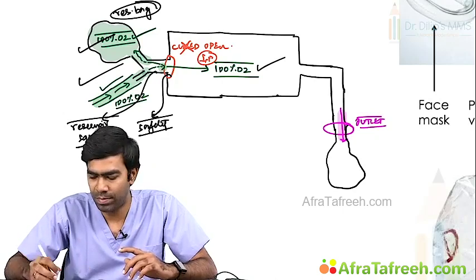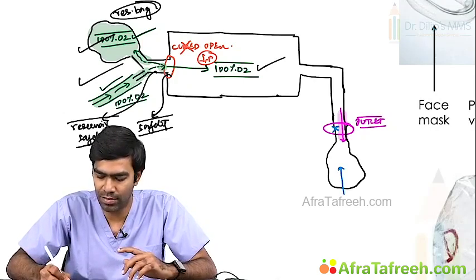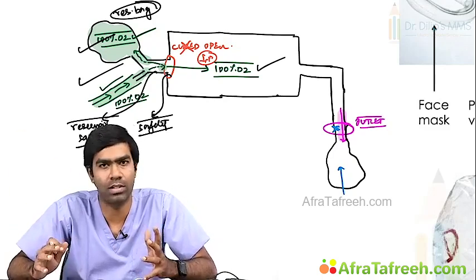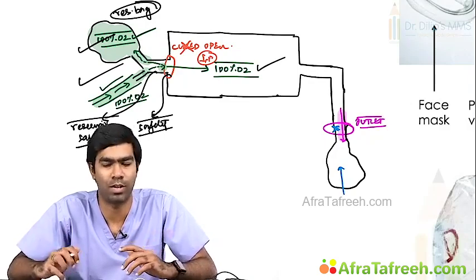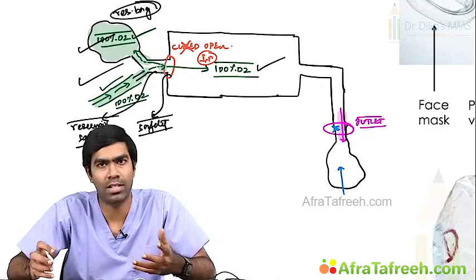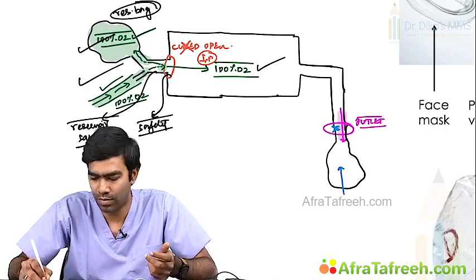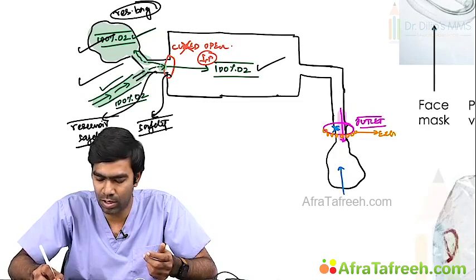Now what if the patient exhales? If the patient exhales, I told you this valve definitely won't allow the gases to escape into the self-inflation bag, because that's the function. It will not allow rebreathing at all. So how are the exhaled gases going to go out then? A lot of ambu bags and any other company's bags also will have these exhalation ports near the outlet valve itself.